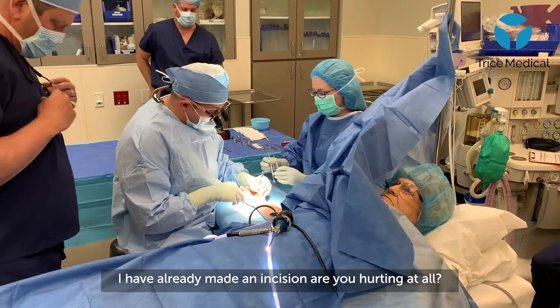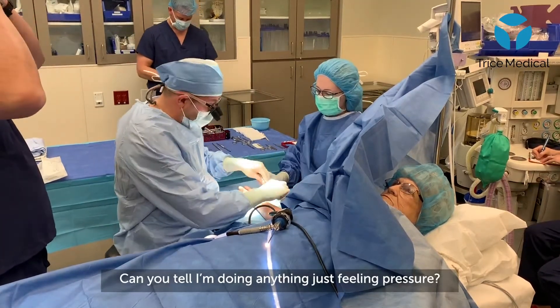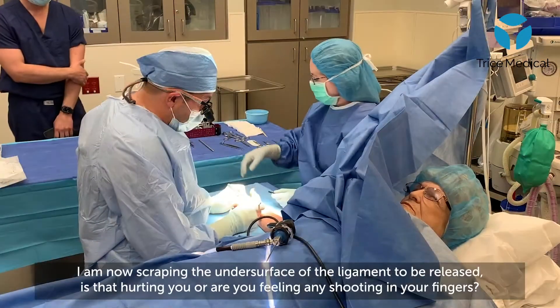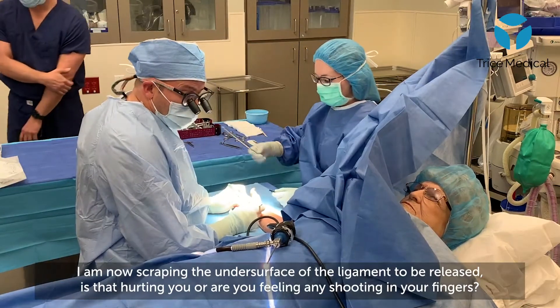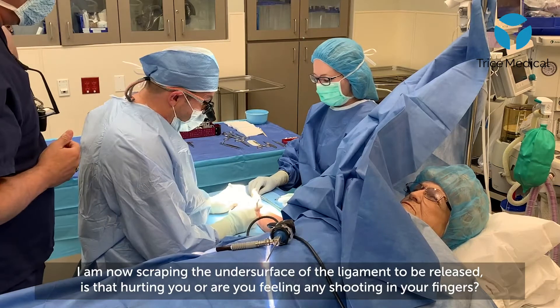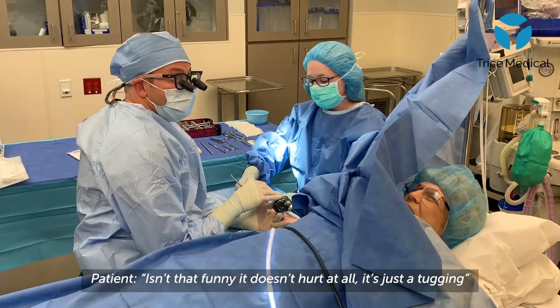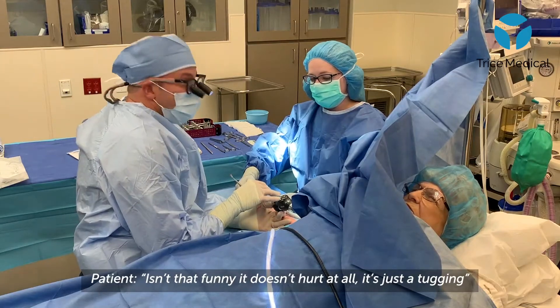I've already actually made an incision on you — are you hurting at all? Not at all. Can you tell that I'm doing anything? Just feel a little pressure? No. So I'm actually scraping the undersurface of that ligament that we're going to release. That's still not bugging you? You're not feeling anything shooting in your fingers? No. Isn't that funny? It doesn't hurt at all — it's just a tugging.